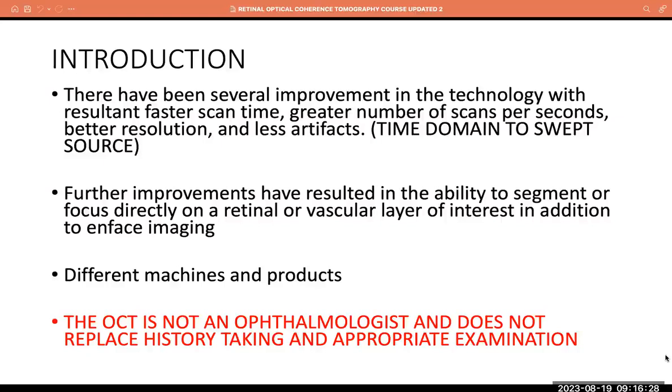It's the resolution, the pixel. Okay, so that's the same thing with the OCT. There are different machines and different products, and each one has its own parameters, but the thing that is constant across the board is the retinal tissue. So imaging it, bringing out patterns and showing changes occur by different means, by different machines.